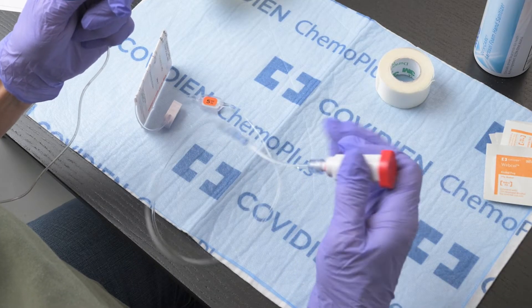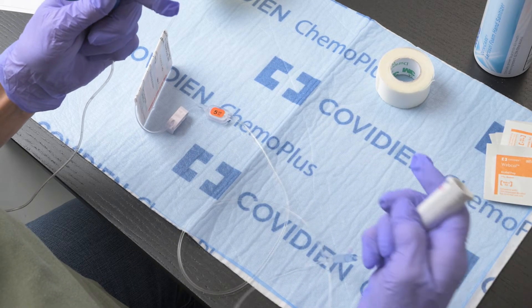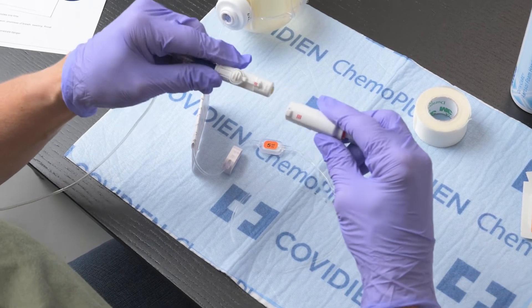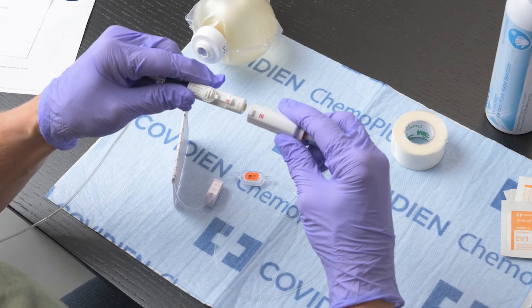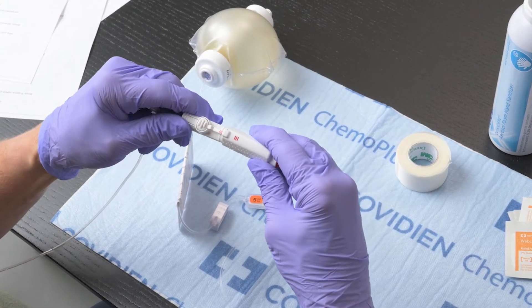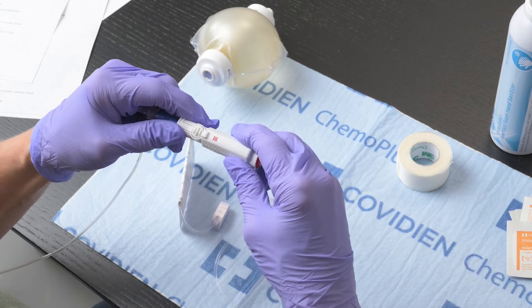Without touching the male connector, remove the red protective cap from the end of the medication tubing. Look for the three red lines on both pieces and line them up. With the lines matching, press the connector together until you hear a small clicking sound.